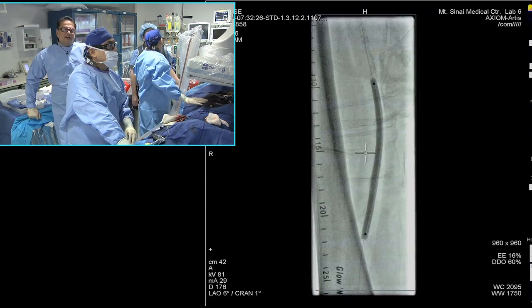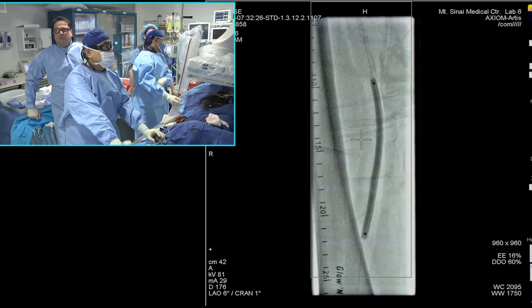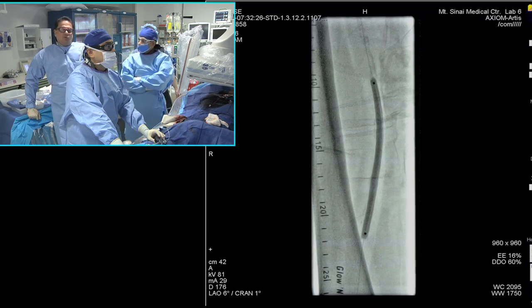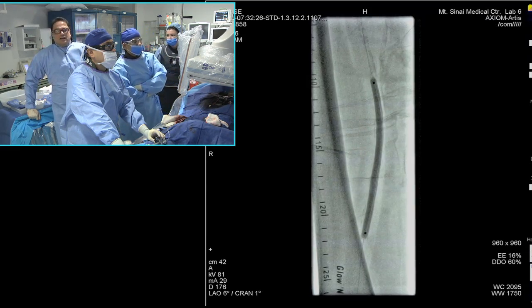So I think at this stage, I agree with you that in terms of our use, if we're going to use a drug-coated balloon, I would have probably used the Lutonix balloon here because I have 150 length, but Sachin obviously made his decision based on great data. So I don't think anything is right or wrong in this situation.